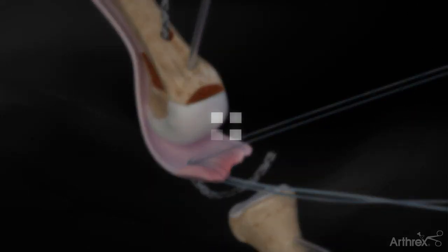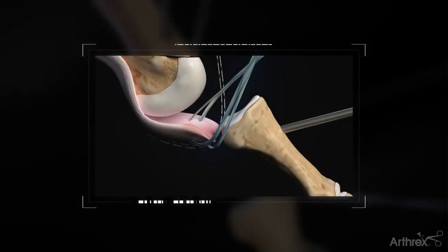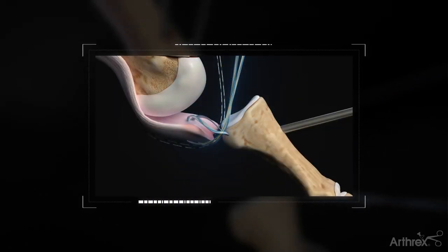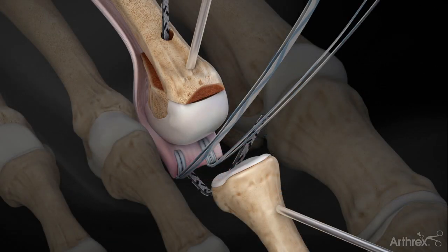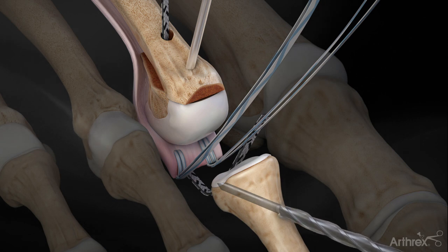Take the suture tape tails from the plantar side, pass them up through the suture tape loop, creating a luggage tag stitch. Pull the two suture tape tails to tighten down the luggage tag stitch to the plantar plate. Then, pass the second suture tape opposite the first stitch in the plantar plate, leaving 3 to 5 mm between.